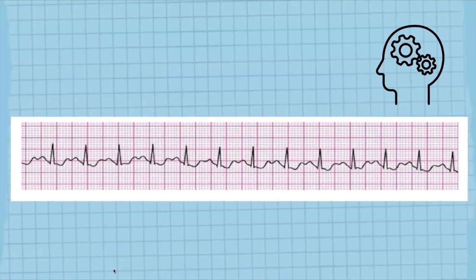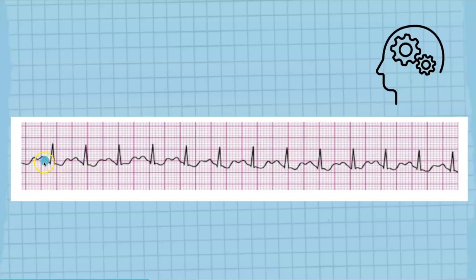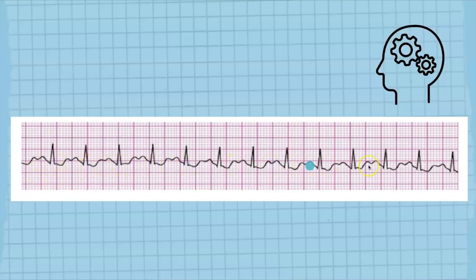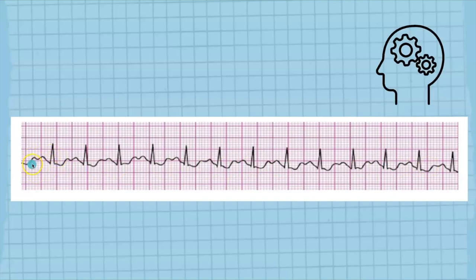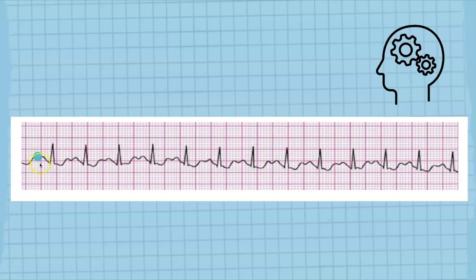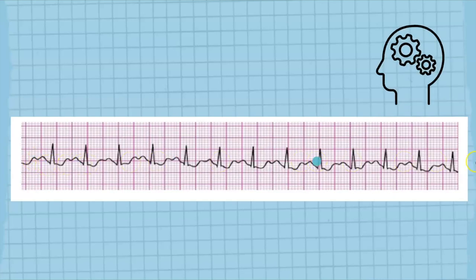The next rhythm that we have — is there a P wave before each QRS? Yes, there is. But the rhythm is going so fast that the P wave is about to be overtaken by the T wave. But so, are you seeing a P wave? Yes, we are seeing a P wave. Obviously this is pretty fast.